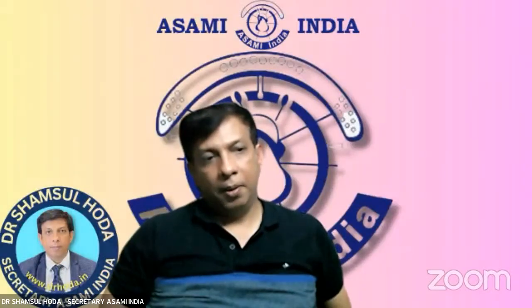We have to be confident that it is a sound union. We will take AP view, lateral view, and oblique views, checking all 4 cortices, and we will also do clinical testing. Then only will we remove the fixator. A thorough checkup, clinical as well as radiological.